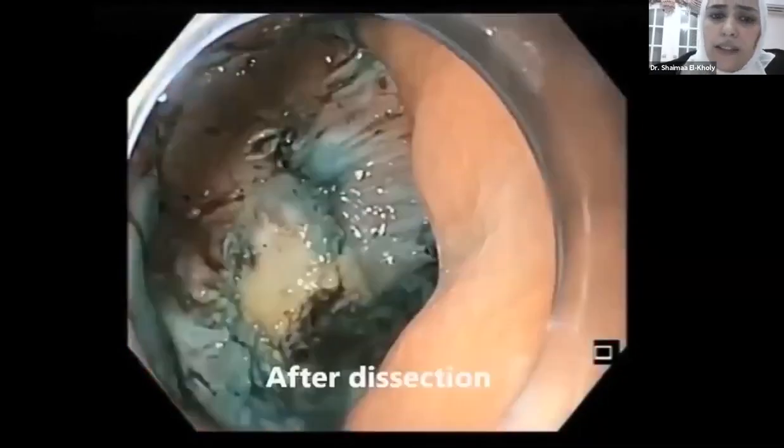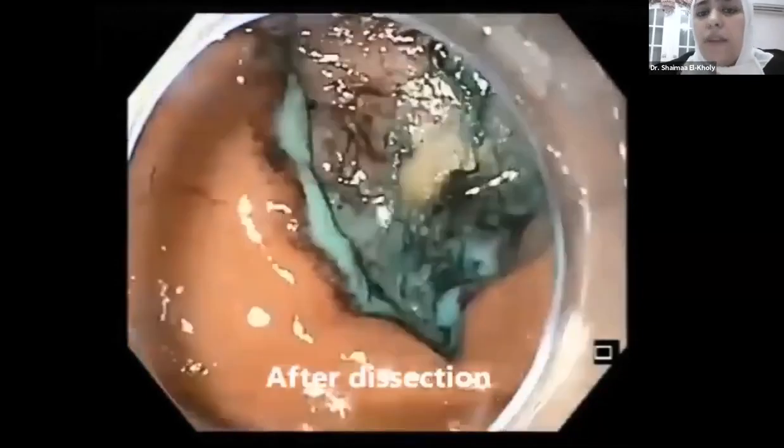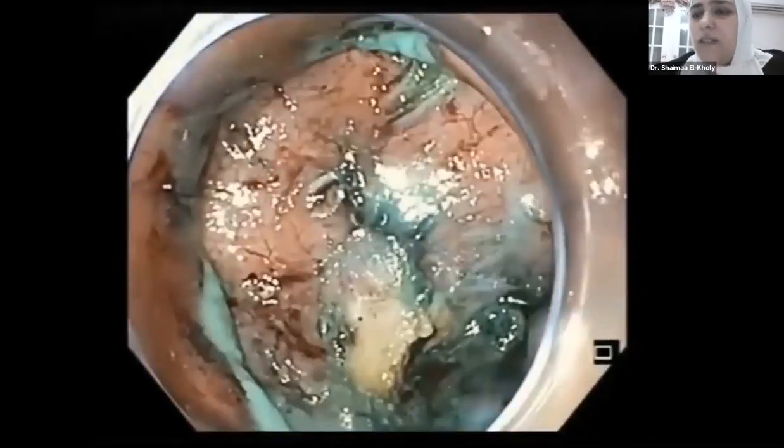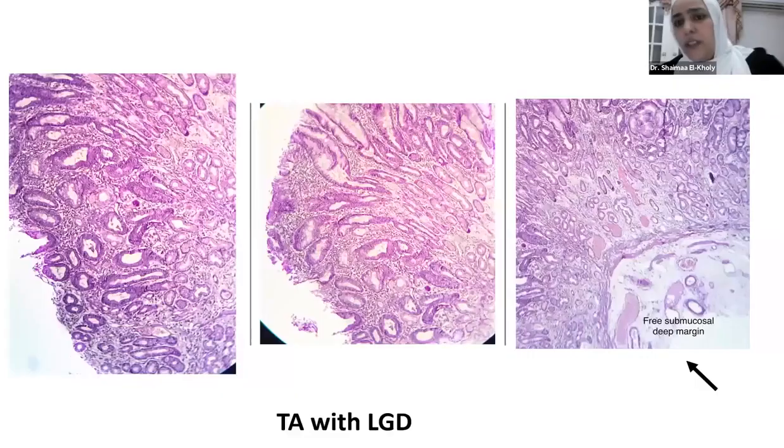At the end of the dissection, you can see that we have dissected the lesion completely. And this area in the middle is just submucosal fibrosis from the other trial, from the previous trial of resection. And here is the lesion. The lesion was shown to be completely benign. It's a tubular adenoma with low-grade dysplasia. And of course, it has a free margin.